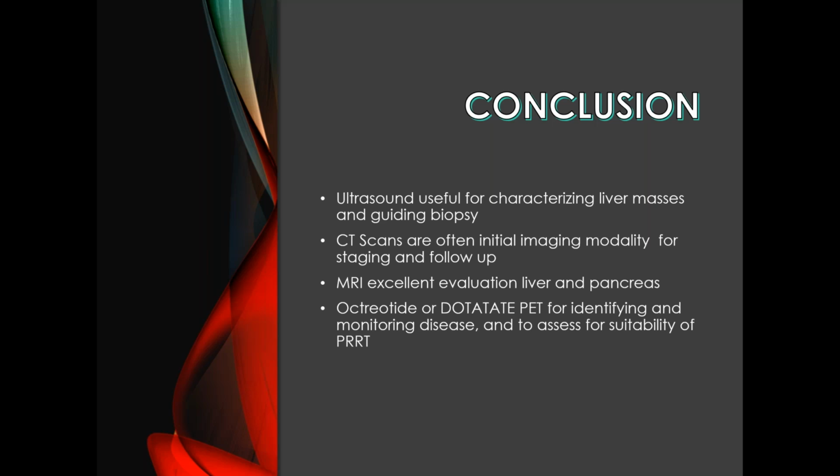DOTA-TATE is something that's coming out right now that we're still not 100% sure how it fits in terms of the algorithm, but certainly with MRI, we do have an algorithm in terms of what to do next, and people are more comfortable with that. So that's what I would say.